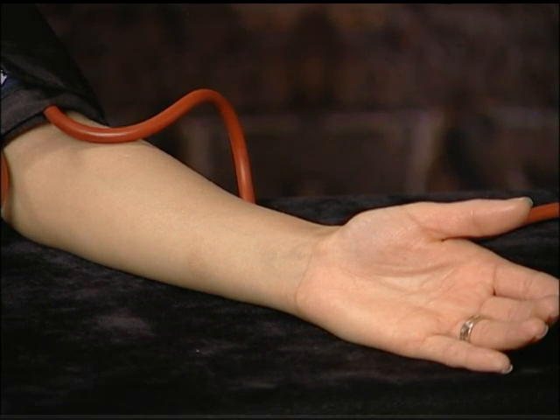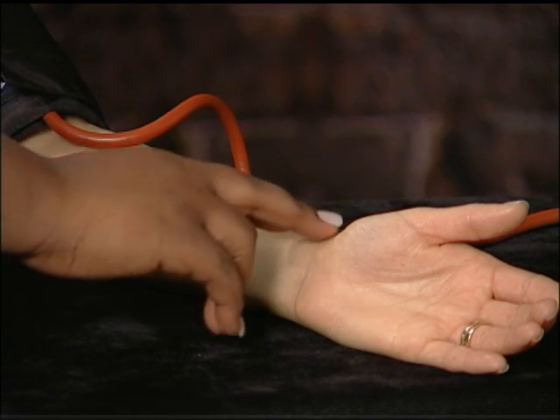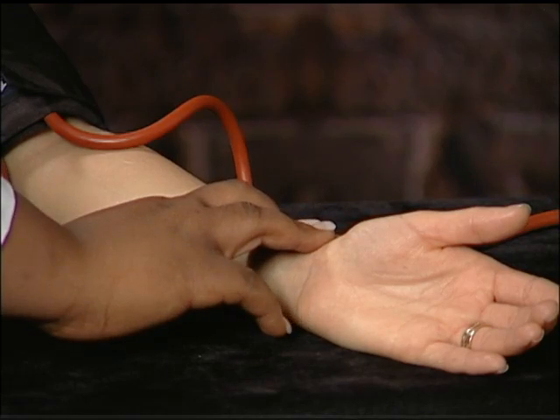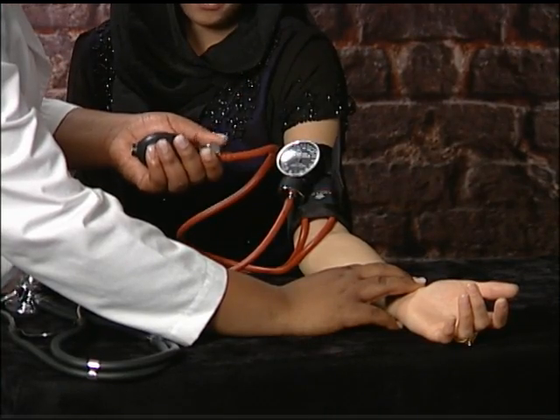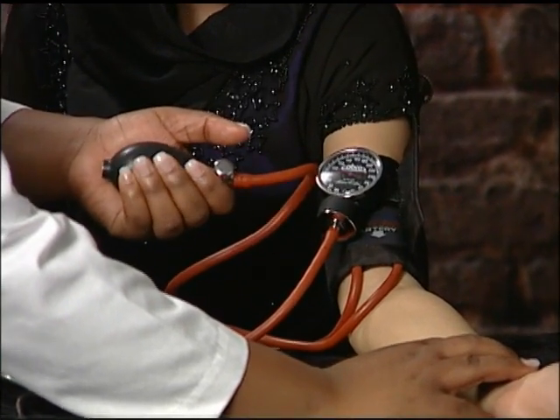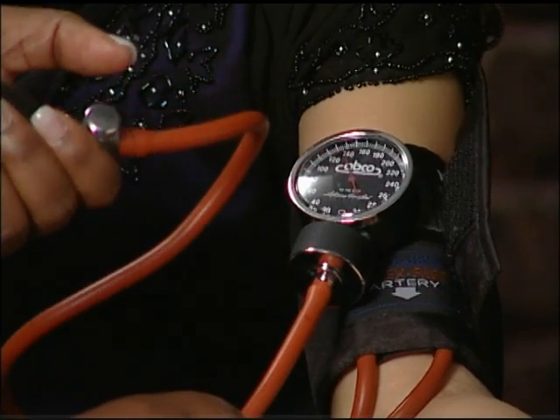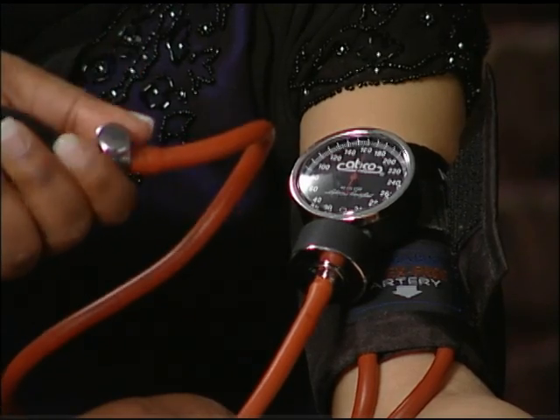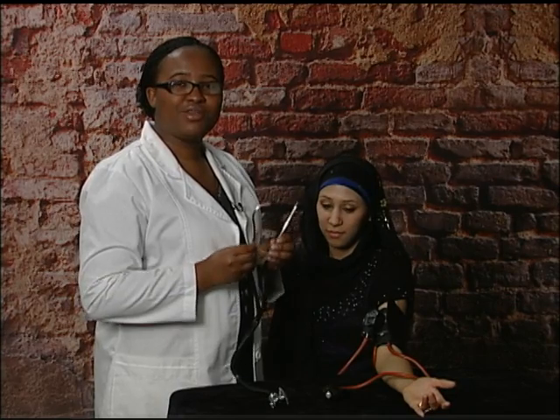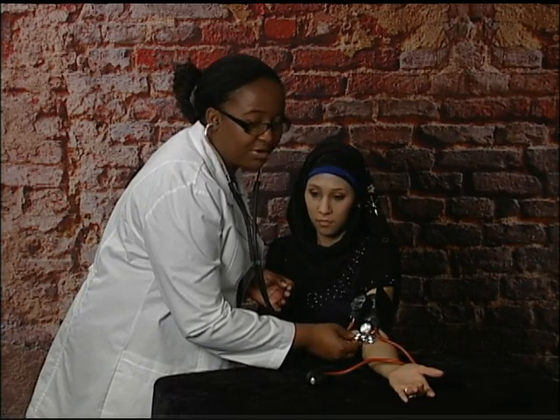Now use your fingertips to locate the pulse on the wrist. This pulse is located on the indentation on the thumb side of the wrist. Inflate the cuff by closing the screw valve and squeezing the bulb. Continue feeling the pulse and watch the pressure reading on the gauge. When you stop feeling the pulse, inflate the cuff 30 more millimeters. Now place the ear pieces of your stethoscope in your ears, then place the large part of the stethoscope over the area of the blood vessel at the level of the arm crease.